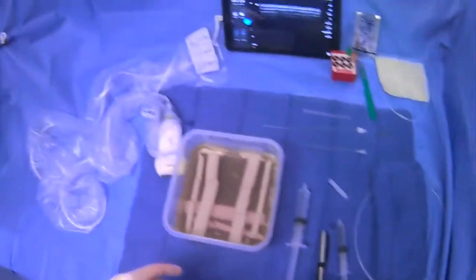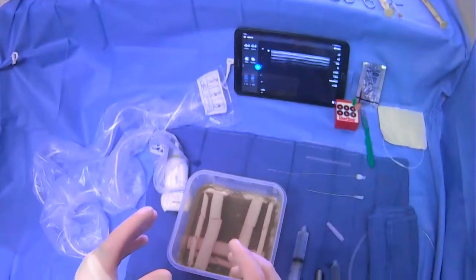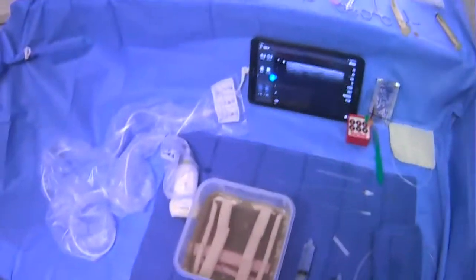That's kind of how we do the skin prep. After we're done with that, we can talk a little bit about prepping the micropuncture kit.